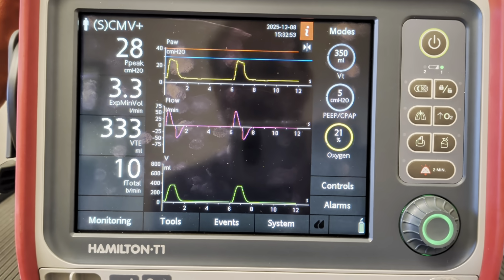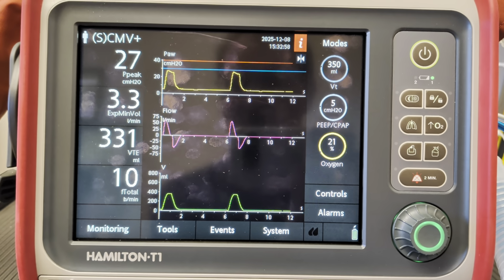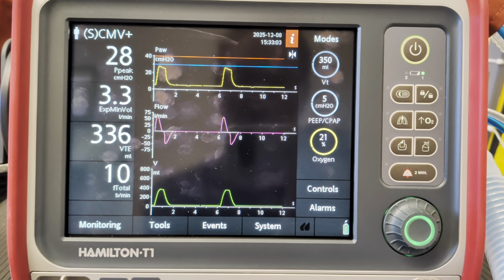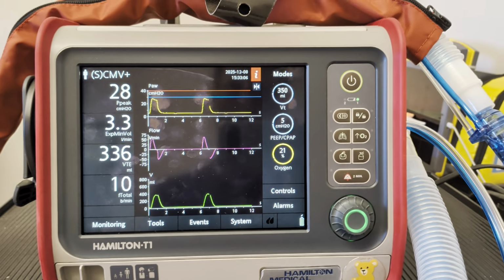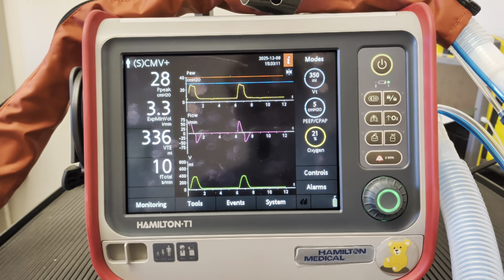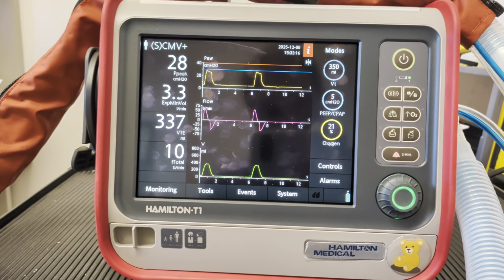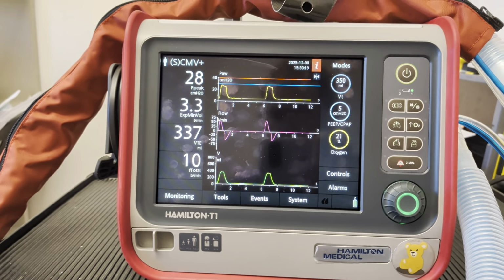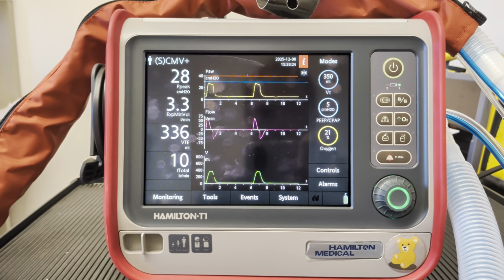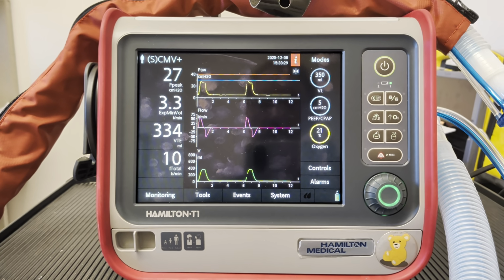And then the other way is increasing mean airway pressure. That is the average pressure experienced throughout the inspiratory cycle, during both the inspiratory and expiratory phase, right? That pressure is opening the alveoli, driving gas molecules, mainly oxygen in what we're talking about here, across the alveoli. And so anything that will increase the mean airway pressure is also going to result in improving oxygenation.